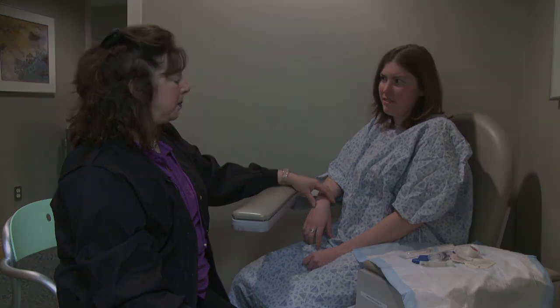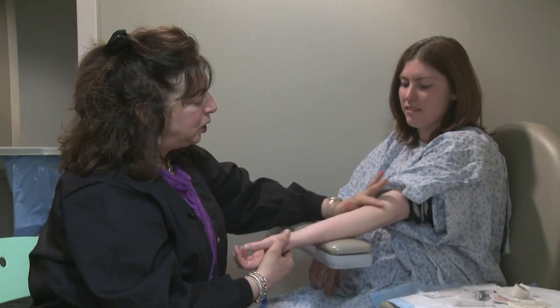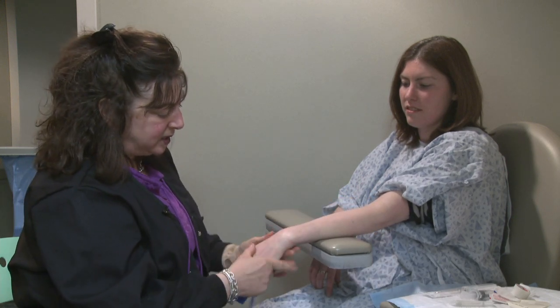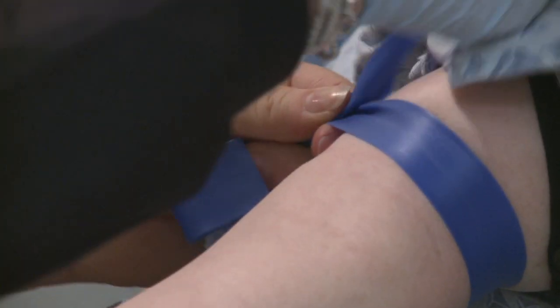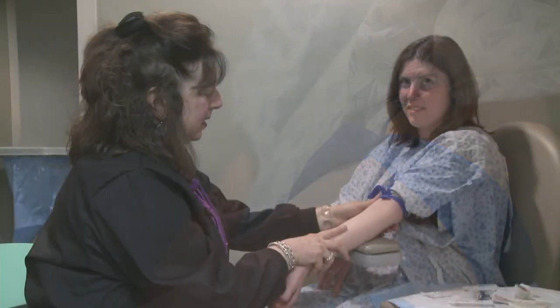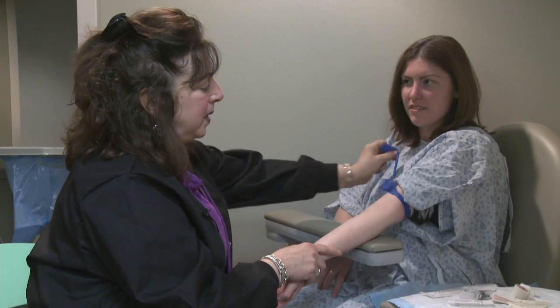Okay, so what I'm going to do at this point is put an IV in your arm. So what I'm looking for now is a vein so that I can place the IV. We look at the antecubital. We look to see if she has a good vein there. If not, we come down to the hand and look for a vein in the hand. So I'm going to put the tourniquet on.